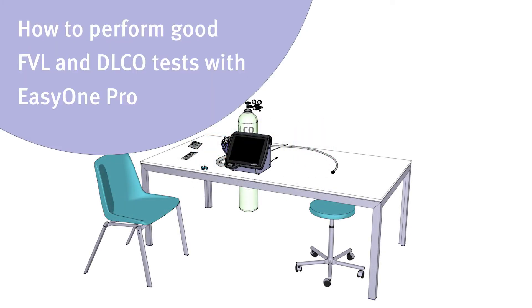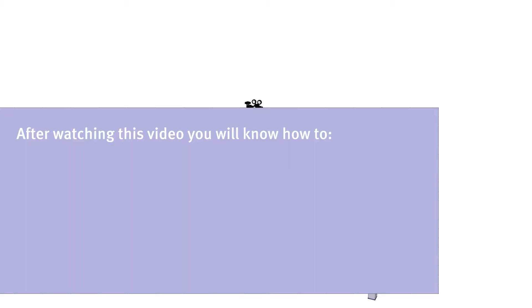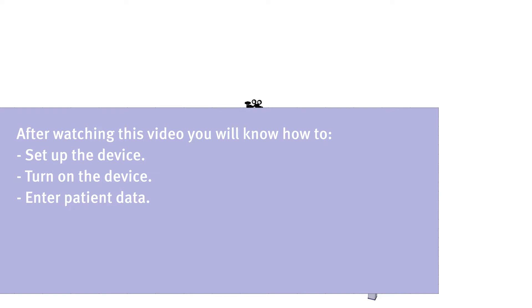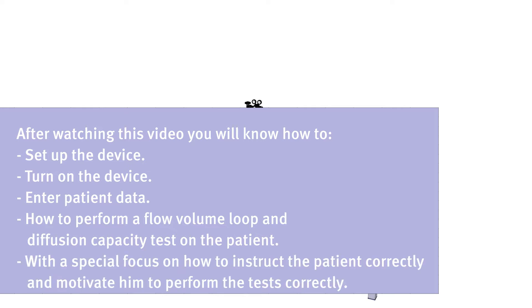How to perform good FVL and DLCO tests with EasyOne Pro. Hello and welcome to this educational movie. Thank you for taking the time to watch this short video. After watching this video, you will know how to set up the device, turn on the device, enter patient data, how to perform a flow volume loop and diffusion capacity test on the patient, with a special focus on how to instruct the patient correctly and motivate him to perform the tests correctly.